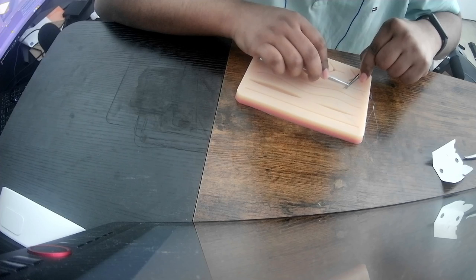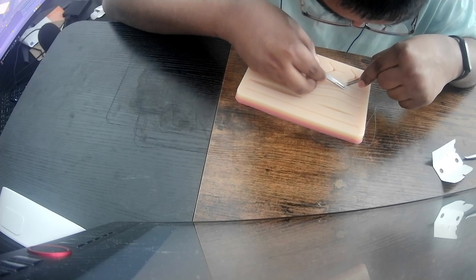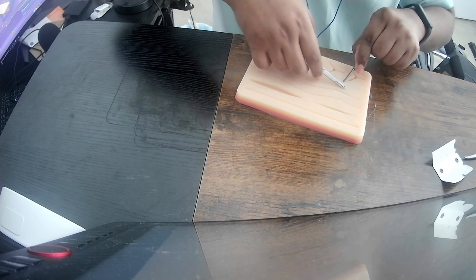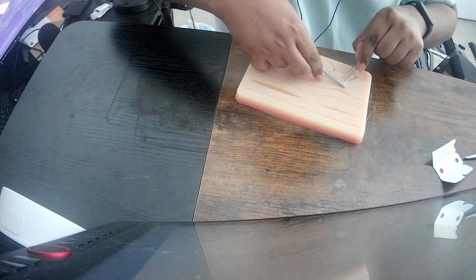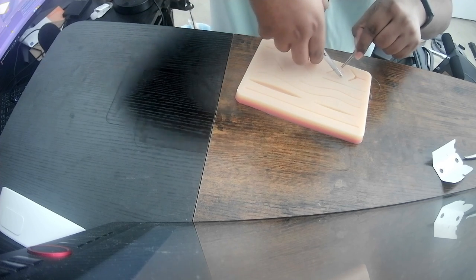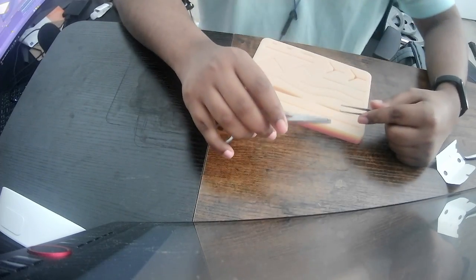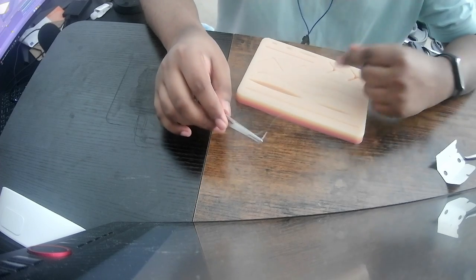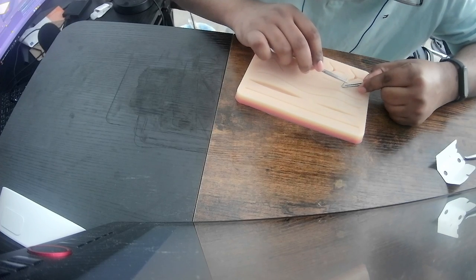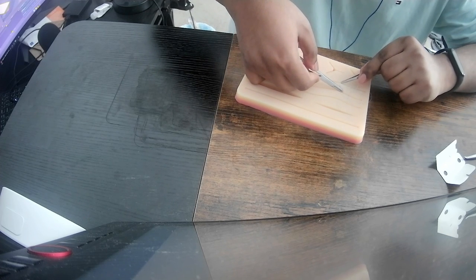Okay, very good. So far, so good. I'm just gonna keep throwing until I reach the end, as I mentioned. So pretty good progress so far. Okay, hold the skin. Drive through. This time I'm gonna actually do it in 2 goes. So I'll drive the needle out.